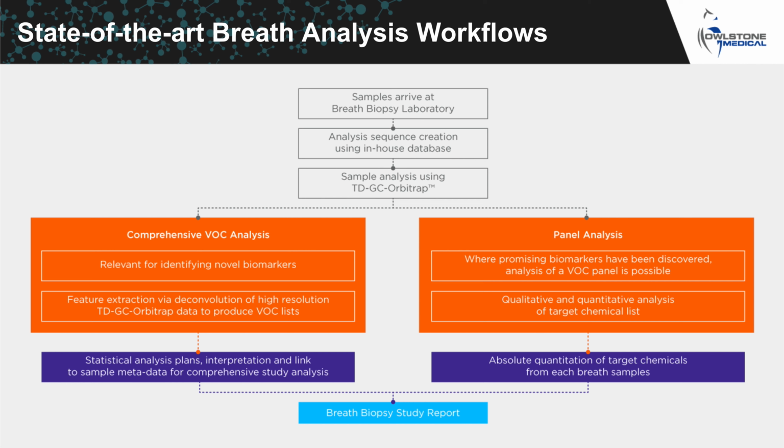The benefits of that is that we can have a targeted panel with absolute quantitation as well as perform a discovery analysis to look for those novel biomarkers and produce feature lists that can go on to statistical analysis and provide data for clinical interpretation. And then the results from both of these approaches can be combined into a single study report. The inclusion of targeted analysis also enables the performance of the instrumentation and that of the breath sample collection to be quantified.